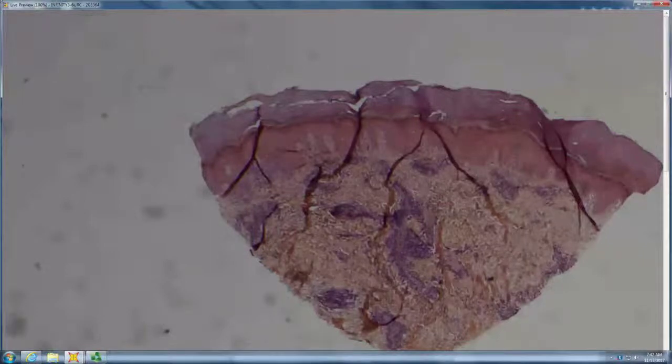So it looks like there's a little bit of papillary dermal edema and then possibly some of those EOs or neutrophils in the vessel. Yeah, mainly neutrophils in this particular one. I did see a rare perivascular eosinophil, but what's in the vessel is mainly neutrophils. So it looks like urticaria perhaps.